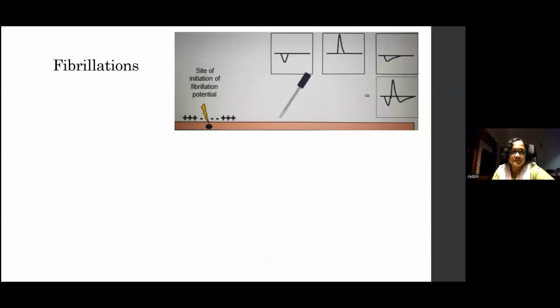So those three different things, insertional activity, motor end plate spikes, and motor end plate noise, these are your normal spontaneous activity. Abnormal spontaneous activity now is fibrillations, positive sharp waves, and myotonia that comes from your muscles, single muscle fiber action potentials. Multiple muscle fiber action potentials give rise to complex repetitive discharges, and you'll have your terminal motor axons as well as motor neurons giving you the rest of the abnormal spontaneous activity.